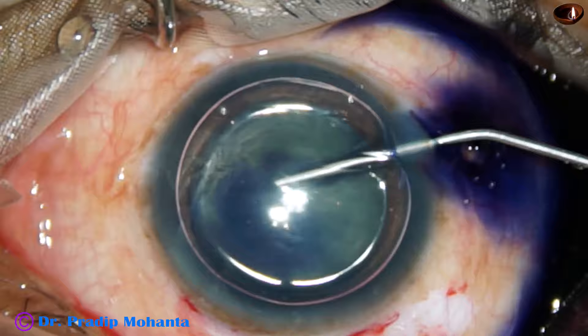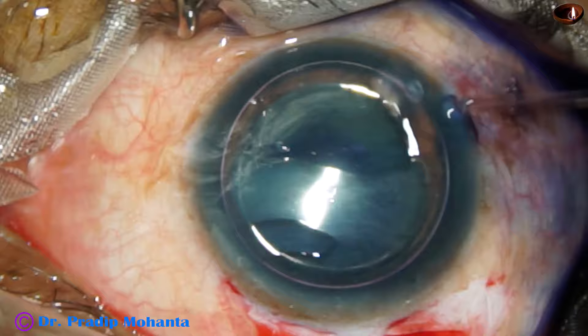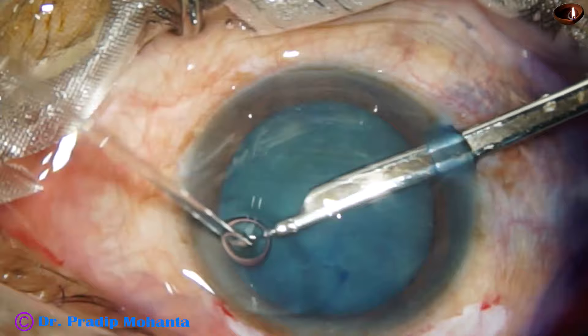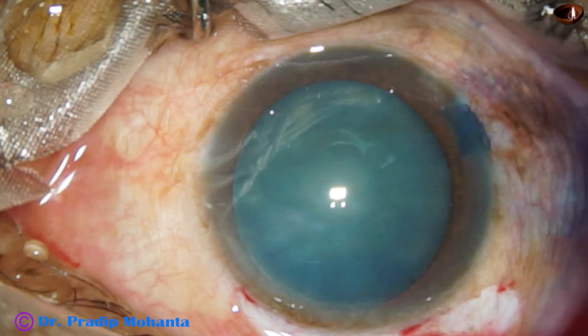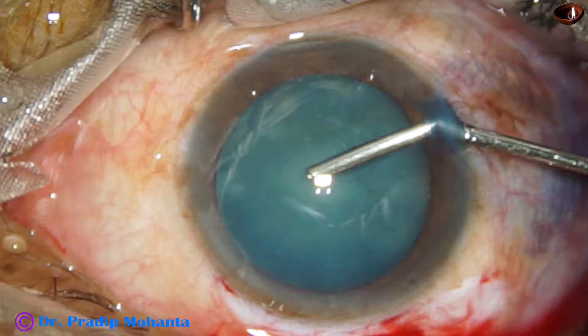After making the side port at 9 o'clock and injecting an air bubble, the anterior capsule is being stained with trypan blue dye. The dye is then washed out. I always wash the dye because sometimes there are some particles and sometimes excess dye remains and goes behind the iris. It is a good habit to wash the dye out, and this will probably reduce the incidence of inflammation in the post-op period.